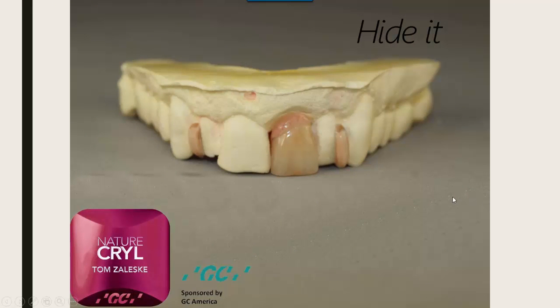Earlier last year I started showing how to mask ball clasps, especially those more forwardly positioned in the aesthetic zone, and how to match those up with the actual tooth being replaced. We'll touch on that as well.